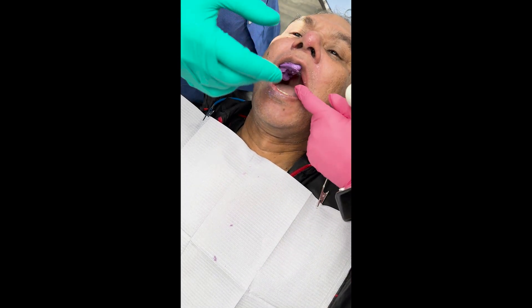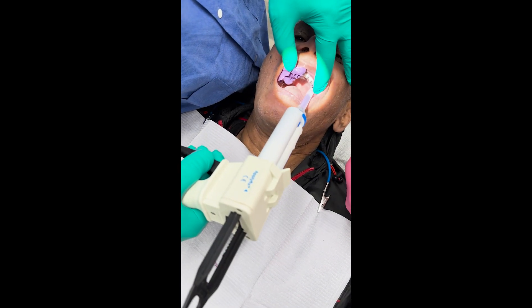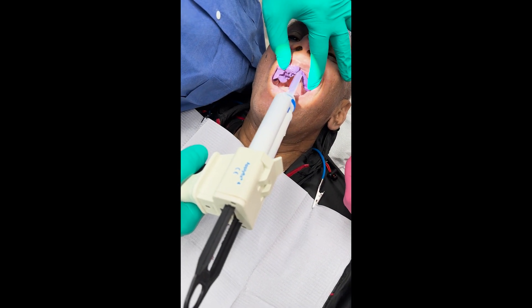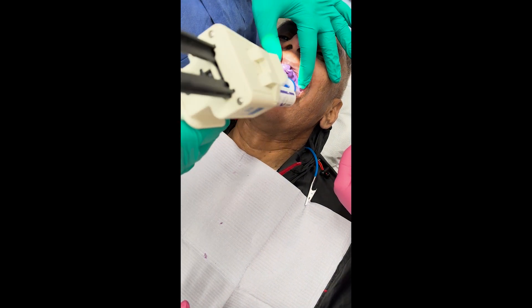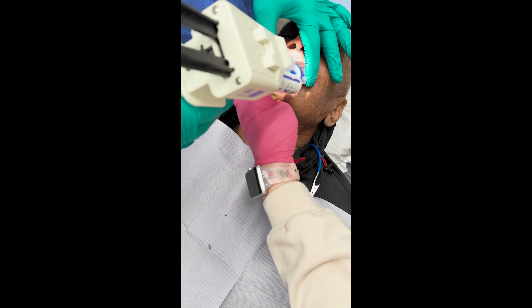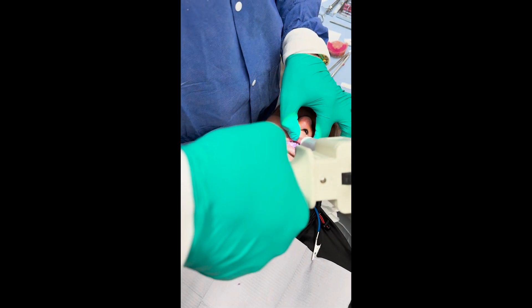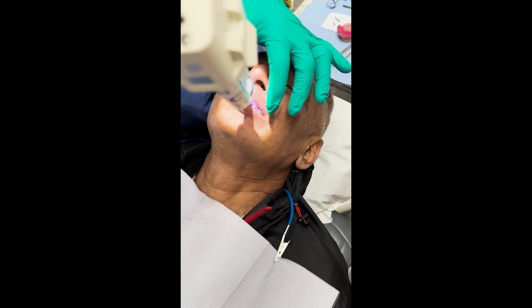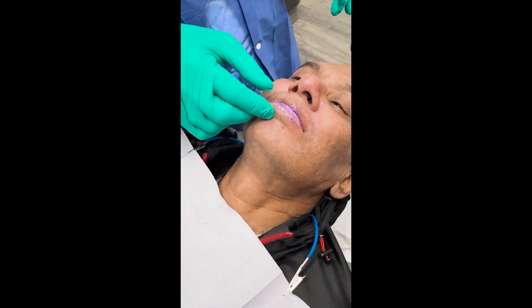We're going to leave this in here and add to the other side now. Bite together again — bite all the way. There's the whole bite — we'll just hold that together for a minute.